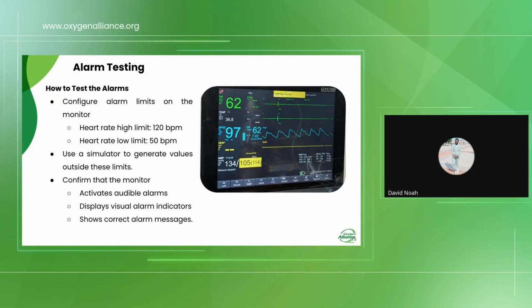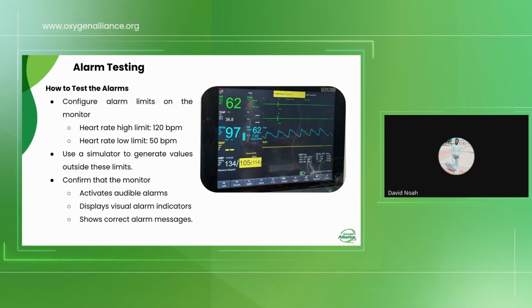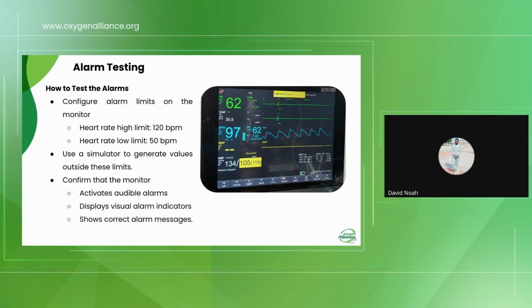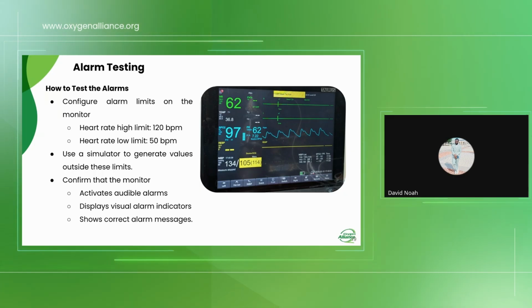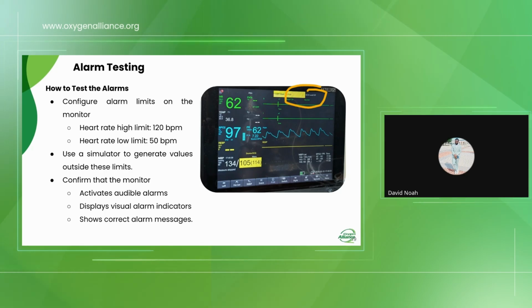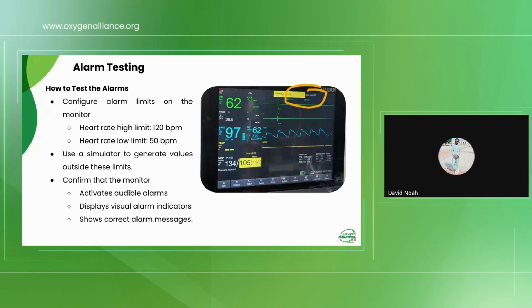Daily alarm testing should involve making sure that the alarms are audible enough to be heard by the clinicians and that they are displayed on the screen so that the clinicians are able to see them as well. On the picture there, we have a section where the alarms are displayed. So basically, the alarm section is somewhere here. Weekly or monthly alarm testing should involve making sure that the alarm limits are set on the monitor.